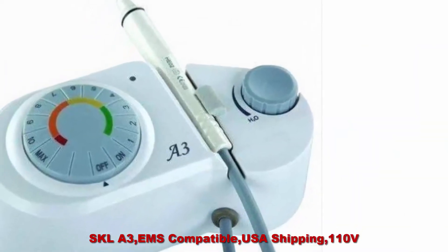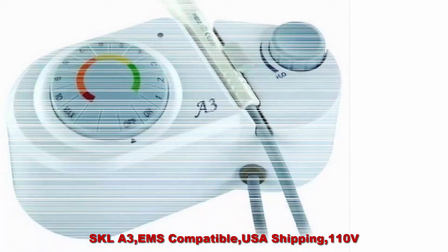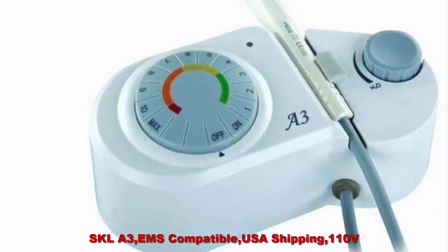Top 3: SKLA-3, EMS compatible, USA shipping, 110V. Intelligent tracking and power feedback system provides maximum protection of the gums, virtually painless treatment, and utmost patient comfort.